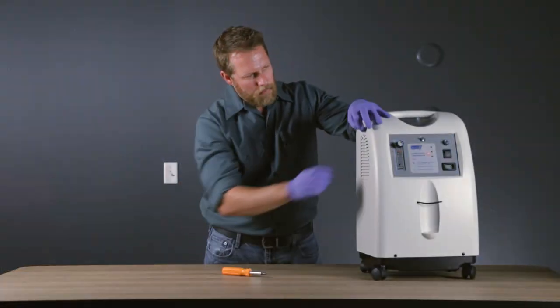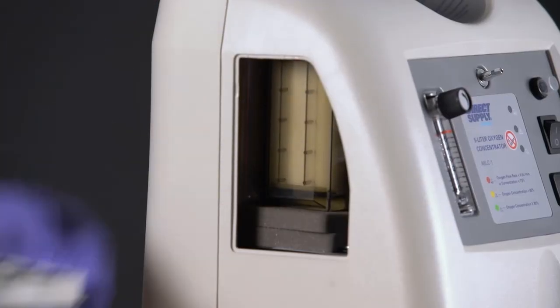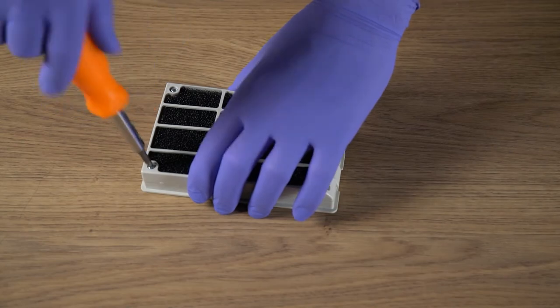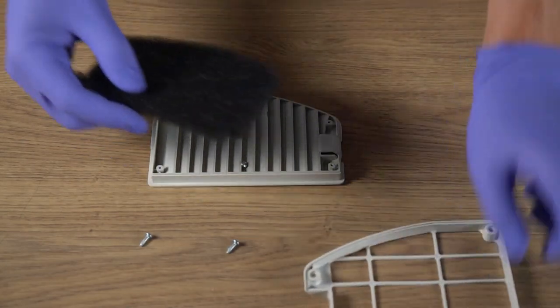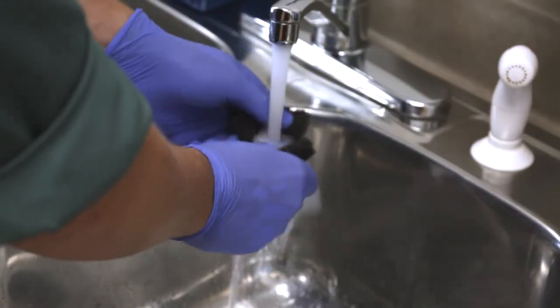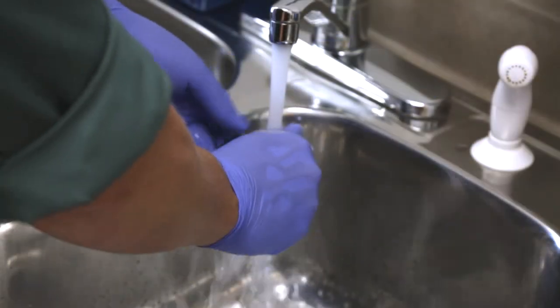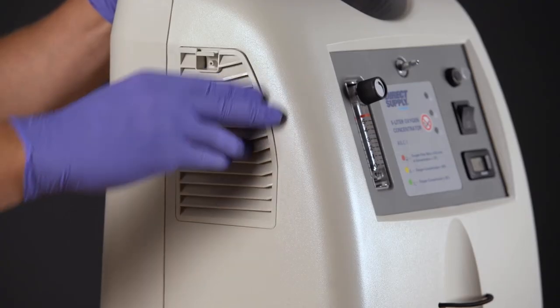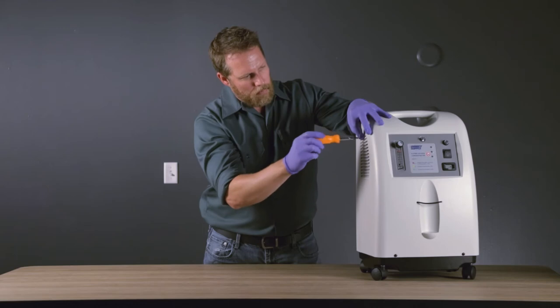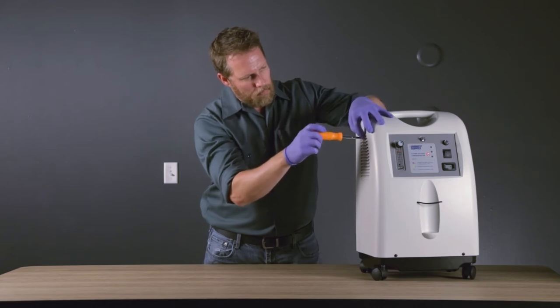Remove the locking screw and the access door on the left side of the concentrator. Unscrew the filter retention frame, and remove the cabinet filter from the door. Wash the cabinet filter with water, and completely air dry before reassembling and returning to service. Reassemble the filter retention frame and door, then place the door back on the cabinet. Reinsert the access door locking screw.